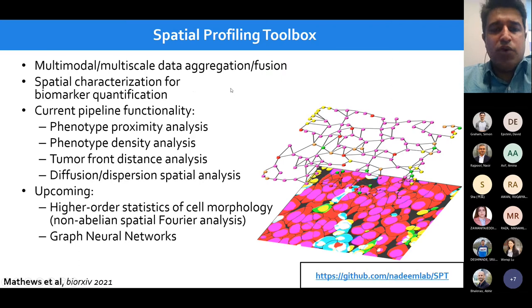And the idea here eventually is that we want to be able to, for example, using vector optimal mass transport, connect multiplex cell graphs, for example, multiplex imaging cell graphs, which either come from our DeepLIIF tool or via ImPartial if the starting point is multiplex imaging. And combine these with, let's suppose, flow cytometry data, single cell RNA-seq data, from which we can again compute graphs and put them together in this vectorial distribution, because essentially they might come from the same samples, etc. And also maybe incorporate spatial transcriptomics. Obviously, there is a lot of work being done in that domain, and we will readily use whatever is widely available and then just interoperate our spatial profiling toolbox with those. We don't want to reinvent the wheel in that domain.